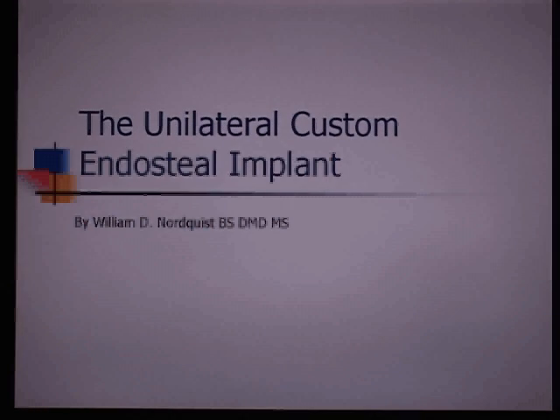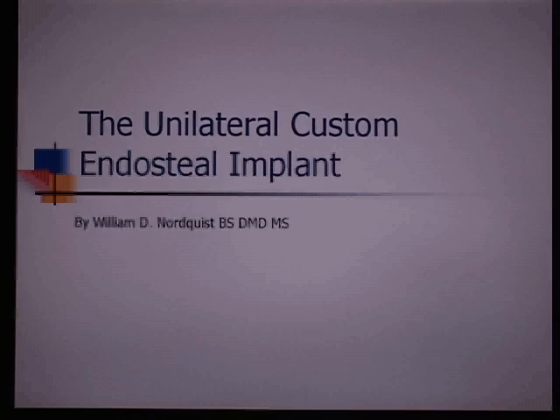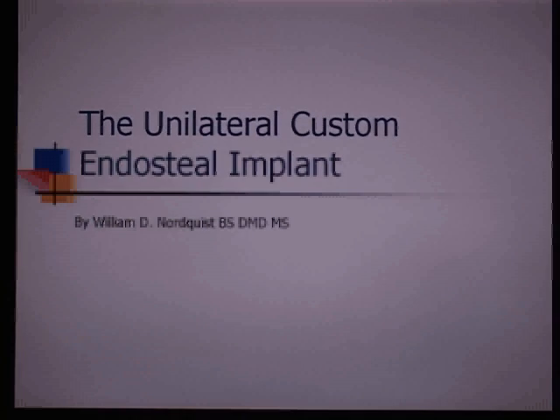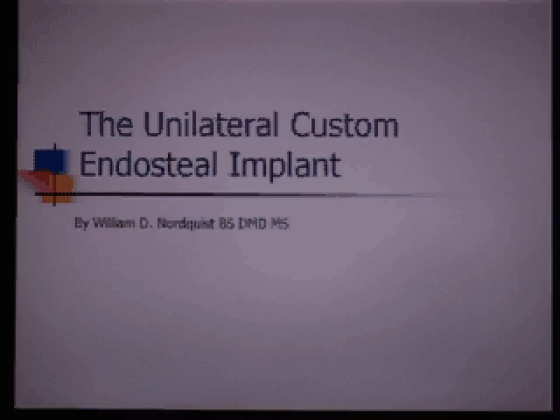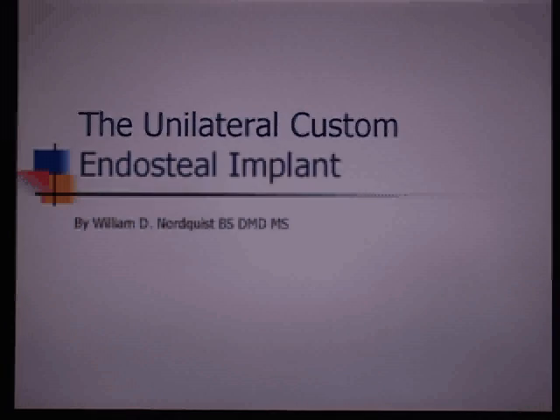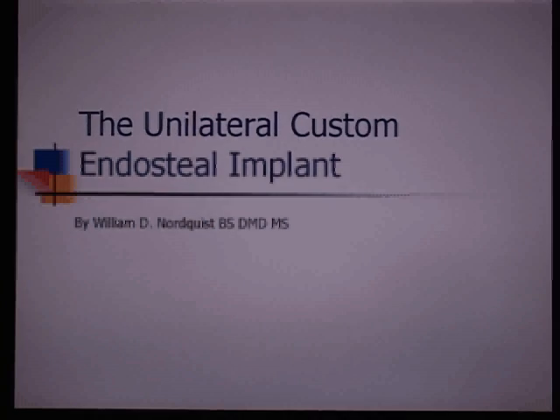The beauty of the unilateral custom Endosteal implant is that when you run across situations in surgery after you flap back the tissue and the patient's expecting an implant, and you find an impossible situation, you know you can't split the ridge, you know you can't augment because basically your two cortical plates are fused together and there's no blood supply. The unilateral custom Endosteal allows you to just get the impression material out, take an impression, and continue on with this modality as if nothing happened. So it's a very valuable modality for full-time implant dentists.